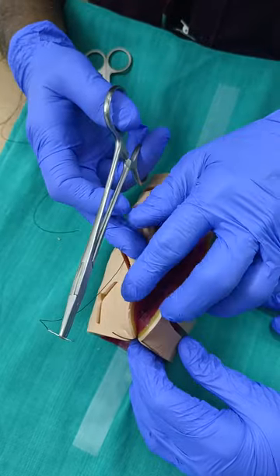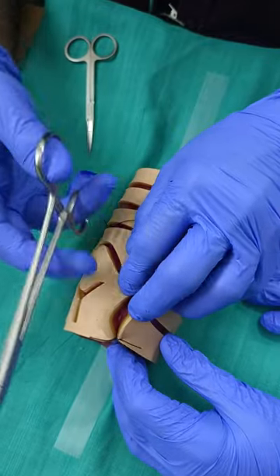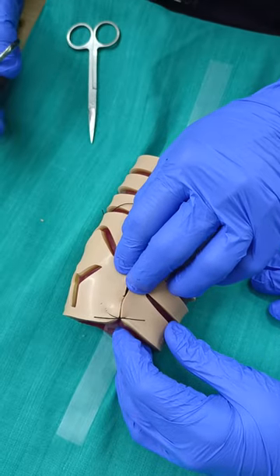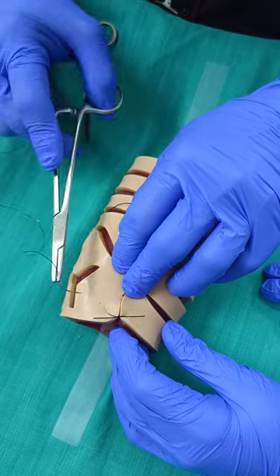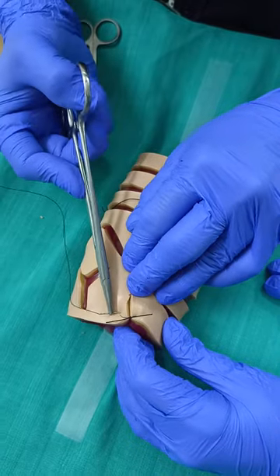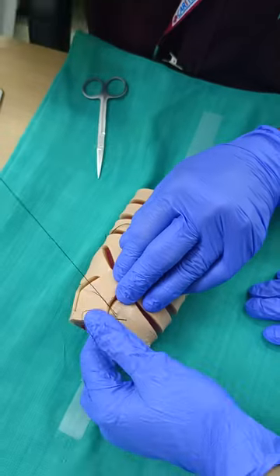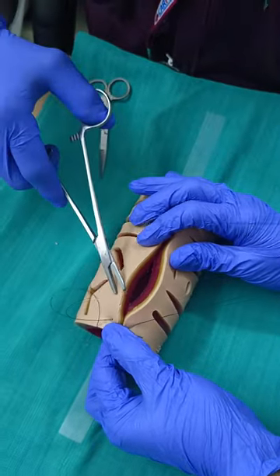Demonstrate how to do the modified mattress suture, or Babu and Magon technique, of uterine closure in cesarean section. The suture material used is number 1 Vicryl. First, as usual, we take the angle of the incision. The first bite will be taking the angle, to secure the angle of the incision.